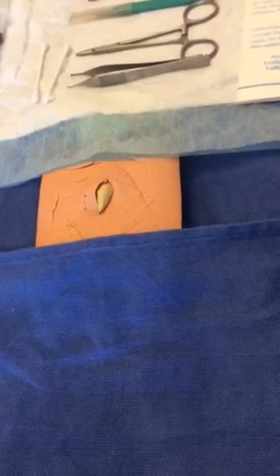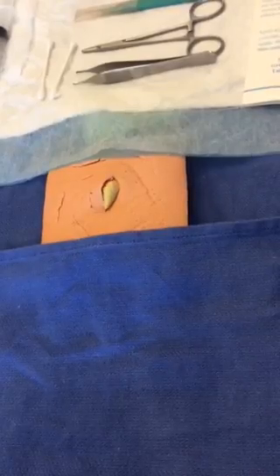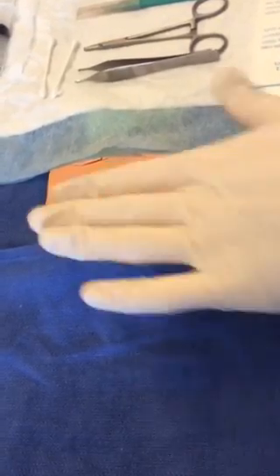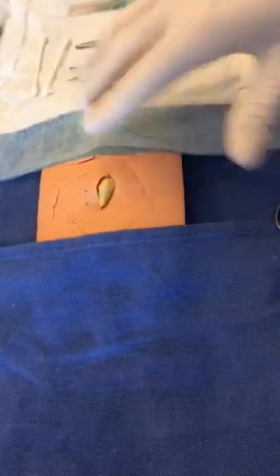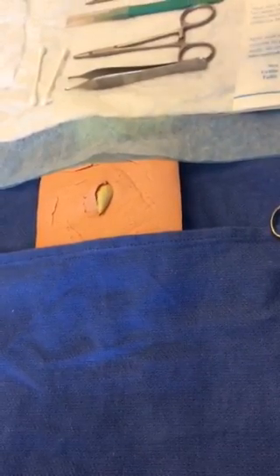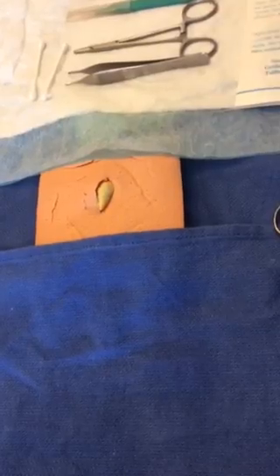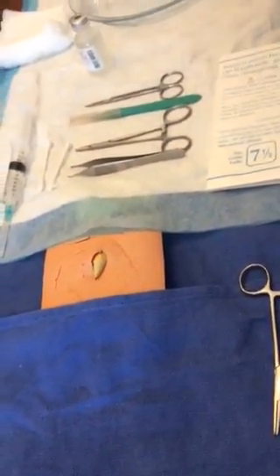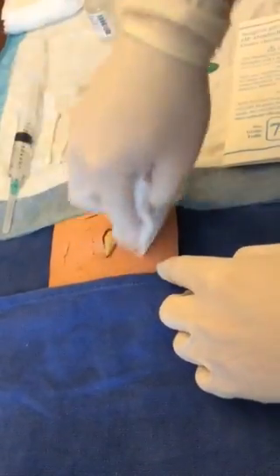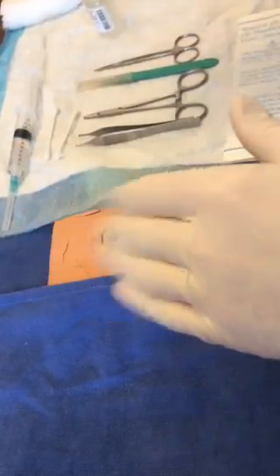Now, what do I need to do it? I need my PPE. I've got to have gloves, and I need to have eyewear because these things can splash sometimes. I need to first numb the area up. I will do that with a 10 cc syringe filled with 1% lidocaine with epi with a 25 gauge needle on the end. I will first prep the skin, okay? I'll prep the skin with just a simple betadine solution.